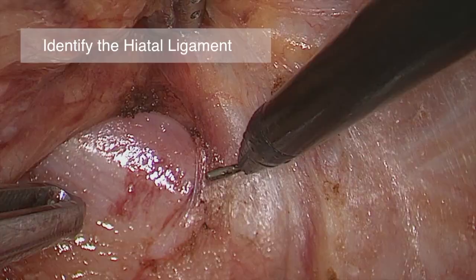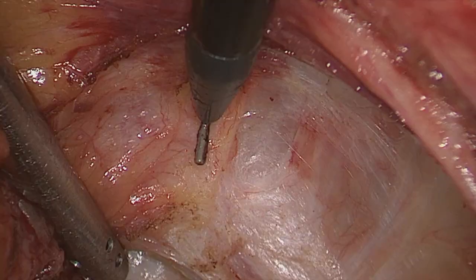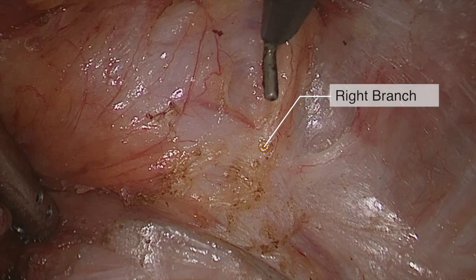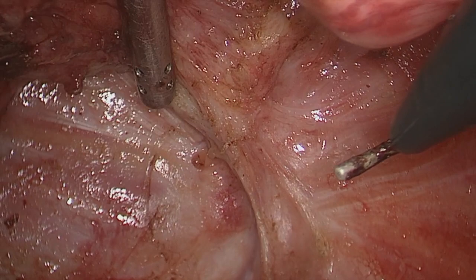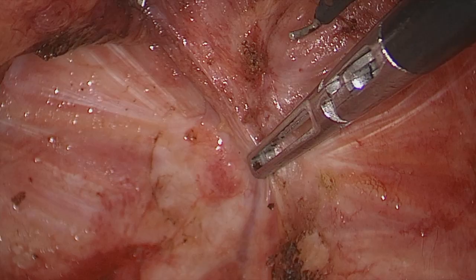According to standard TME principle, when the rectum is completely mobilized down to the pelvic floor, the hiatal ligament can then be identified as a padding between the levator ani hiatus and the rectum. The hiatal ligament consists of one trunk and two branches. The trunk roots on the tip of the coccyx, and the two divided branches embrace the rectum from both sides at the levator ani hiatus level.